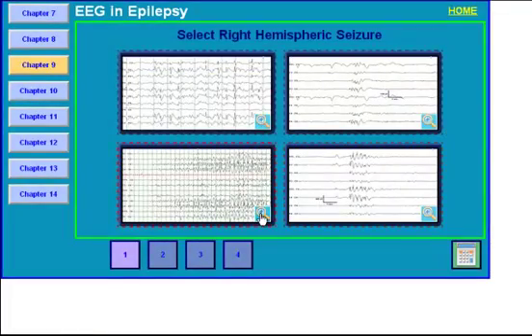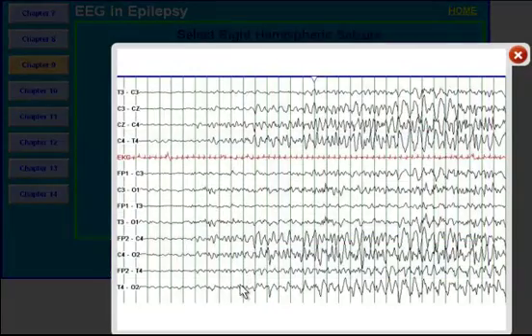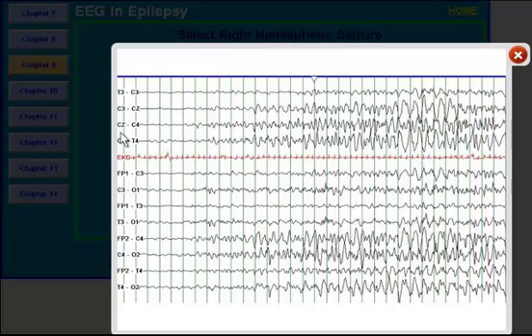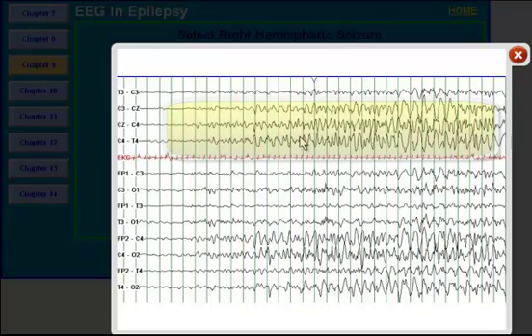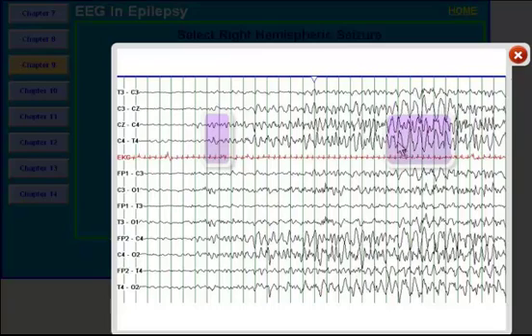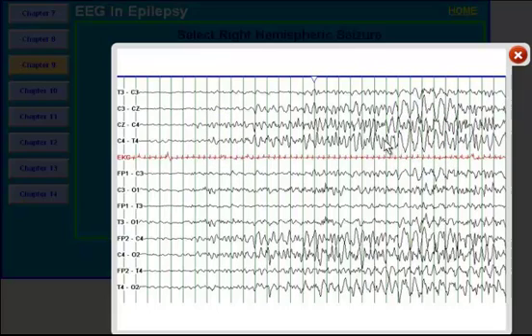Now I have compressed the EEG, so the dark green lines still represent 1 second each. The odd numbers record electrical activity from the left side and the even numbers from the right side. What you see here is this frequency that evolves in frequency and amplitude. Look at the amplitude here and compare with the amplitude later on. There is a clear beginning here.